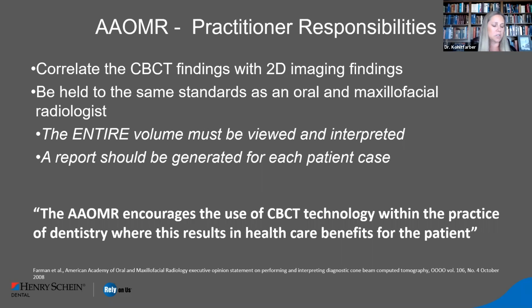You have your assistant sitting next to you, and as you review the case, which patients love to see themselves on CBCT anyway, you're just mentioning all these things, and your assistant is typing it all into that patient record. And therefore, you have a report.